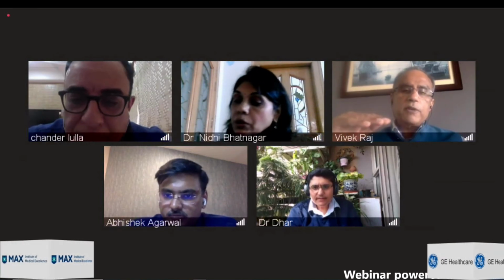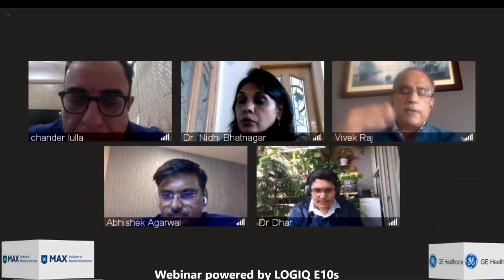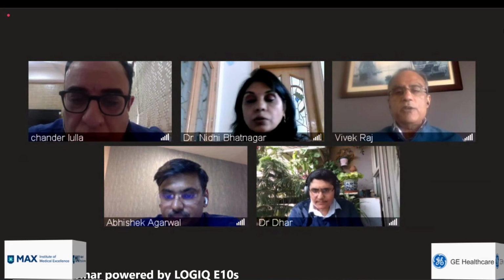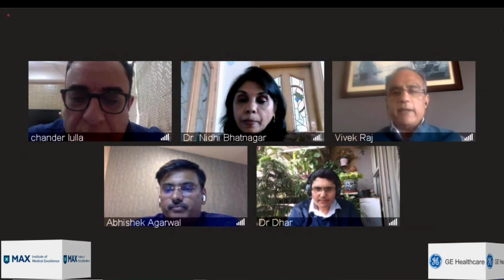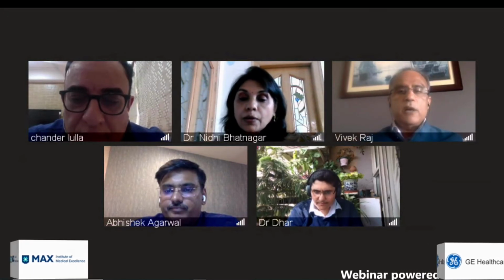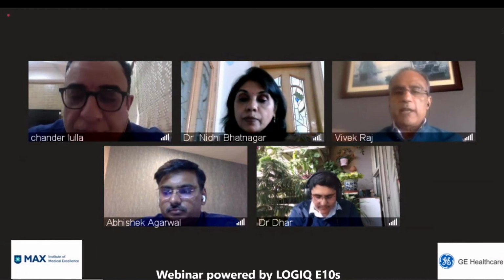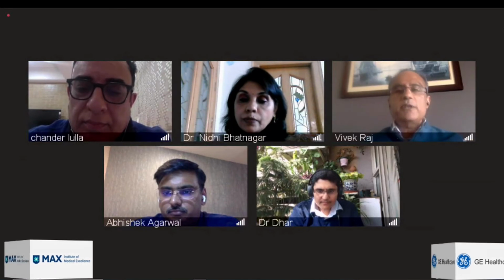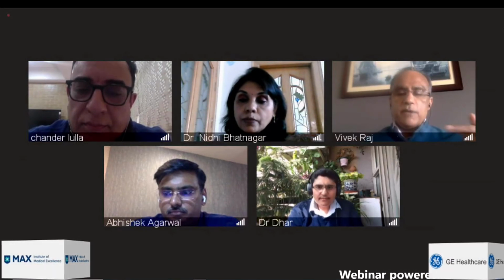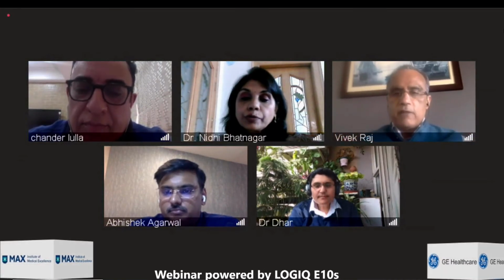Our threshold for doing fibroscans or elastography has changed significantly over the last maybe 8 to 10 years. So if the same question was asked to me, the patient comes to me with fatty liver, will you get an elastography done or will you do a fibroscan? I would have said no, because it's expensive. It's not going to change my management. The patient is going to do exactly what we are supposed to do, lose weight, exercise, and so on. But with more availability, more experience of using it, and better parameters now being available, we are using it as an entry screening for patients who come in with fatty liver, grade 1, grade 2, grade 3.